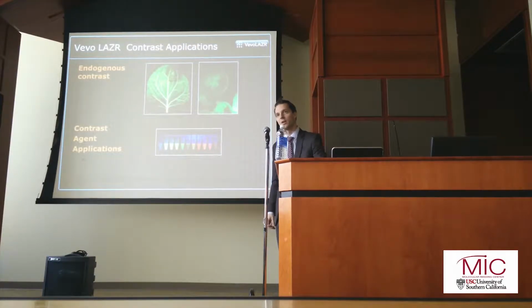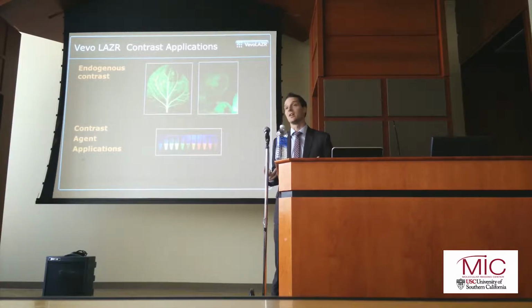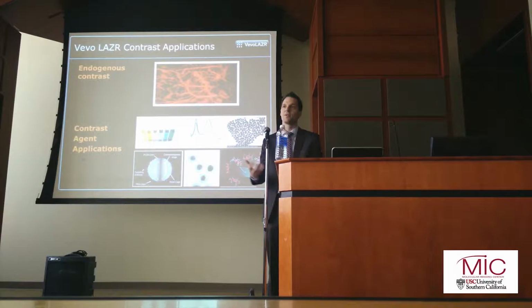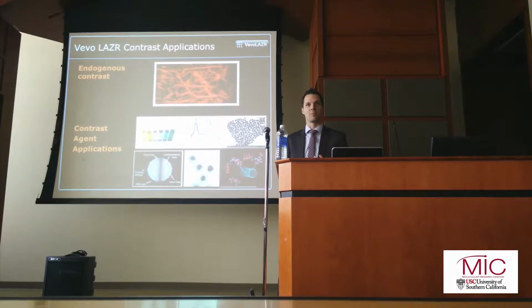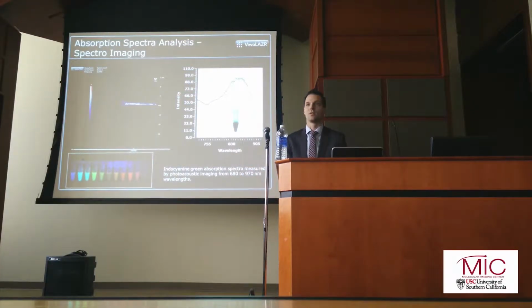As far as analysis goes, I want to talk a bit about contrast agents. So everyone's familiar with the fluorescent agents, where initially these were discovered in things like jellyfish, and since then, many, many different kinds of fluorescent agents have been developed. I kind of liken that to the situation with photoacoustics, where we have this endogenous signal, we have this hemoglobin signal that we can see already, but there are many different contrast agents which are being developed, things like gold nanorods, carbon nanotubes, liposomes, dyes even, all sorts of different things which can be used as contrast agents for photoacoustics to do molecular imaging applications.